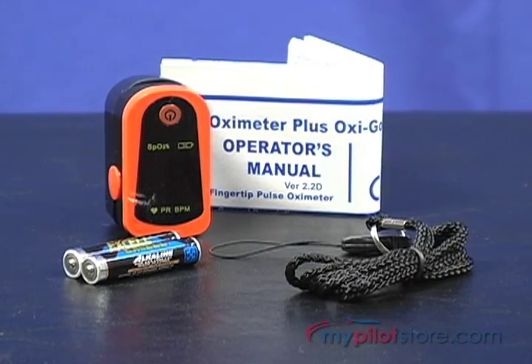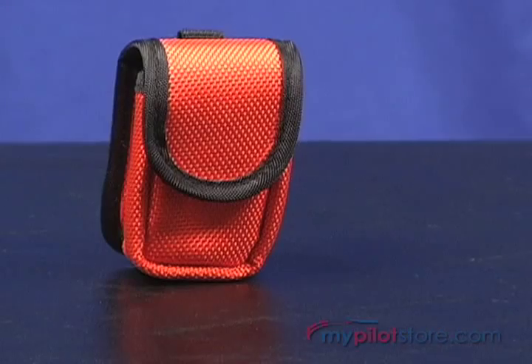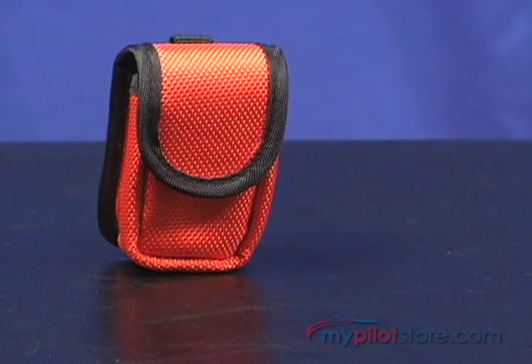The OxyGo ships with one set of batteries, a lanyard, and a detailed user's manual. It is covered by a two-year manufacturer warranty, and a protective carrying case can be purchased separately.